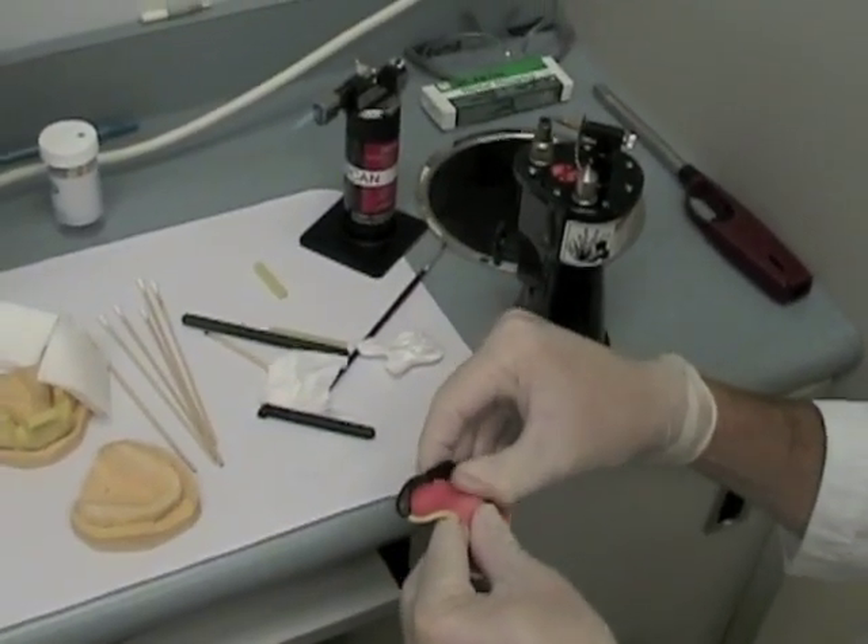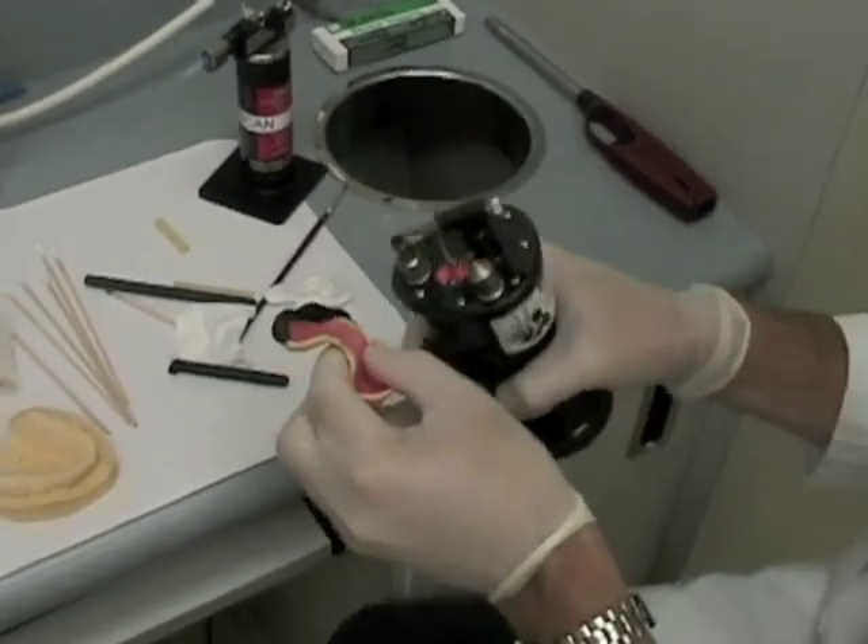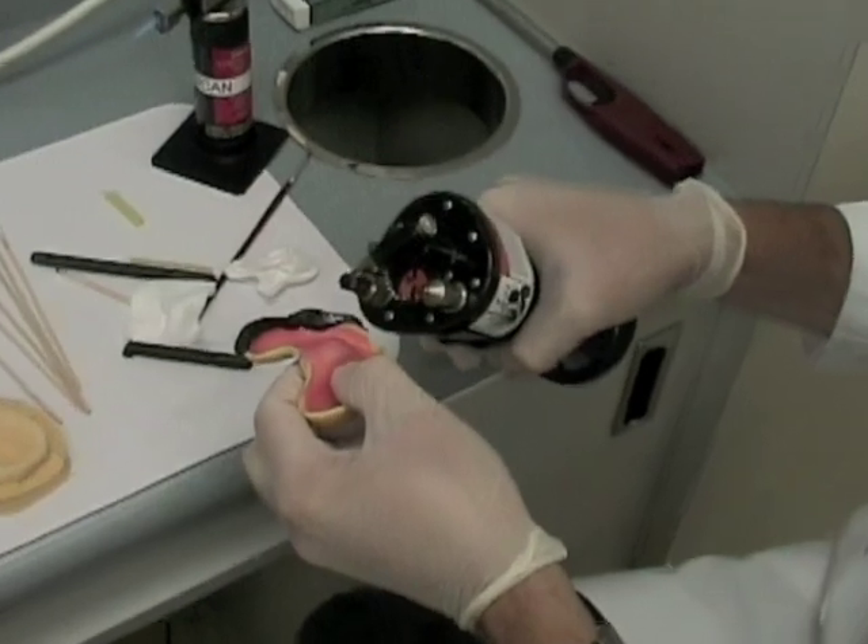If you need to, you can actually shape the compound with some wet fingers. This may get it in the right place to be able to mold it more effectively.